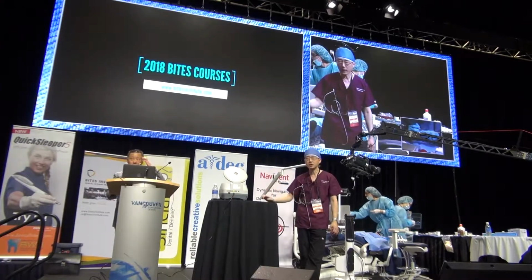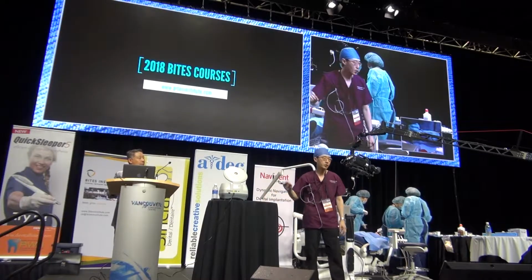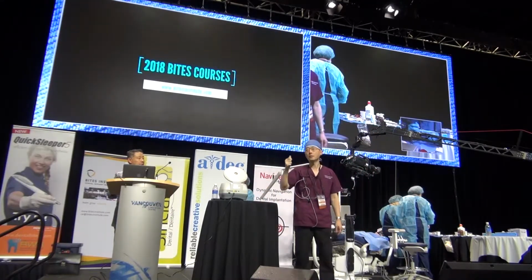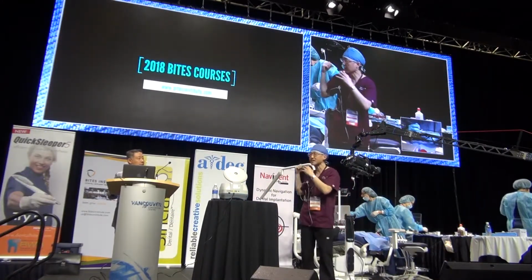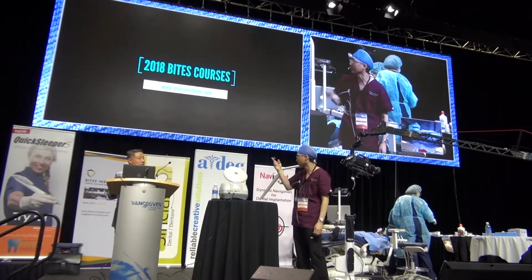These cases, people ask me, aren't you increasing the risk of implant failure by doing this? The most common complication of immediate loading anterior cases is not implant failure. It is temporary breakage. Okay, so they do have to watch out what they eat. I will show you how we modify the S6 stent so that they can wear it nice so that it prevents from touching. We'll do that later on, okay?